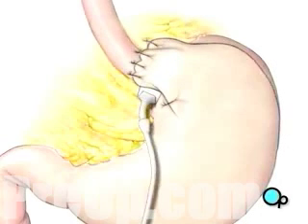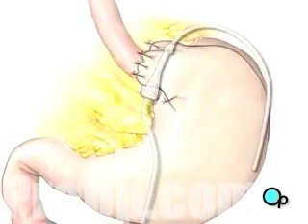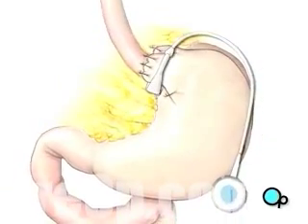The remaining portion of the tube, used to pass saline into the band, will be trimmed and a special valve will be attached. The valve will be sutured into place just below the skin in the upper left area of the abdomen.